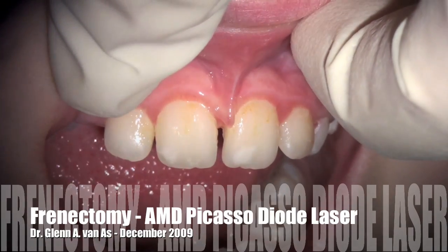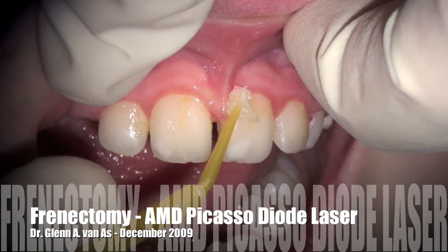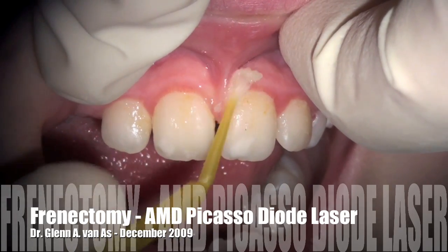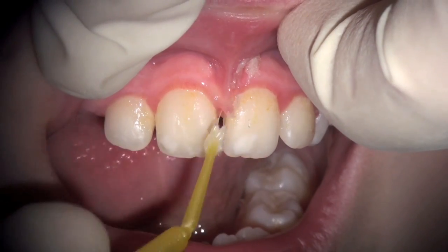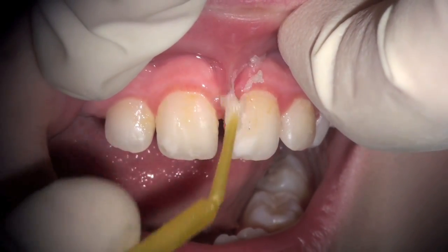In this video we're going to see a maxillary frenectomy done with the AMD Picasso diode laser on a nine-year-old, utilizing both topical anesthetic as you see here being applied — one of the stronger anesthetics like EMLA.